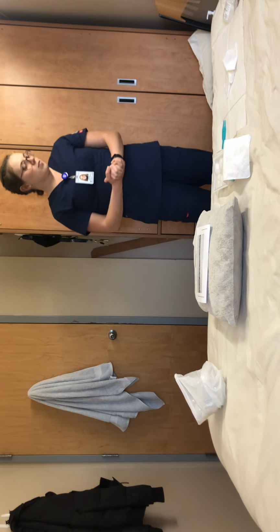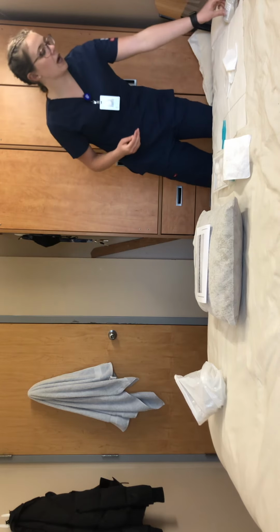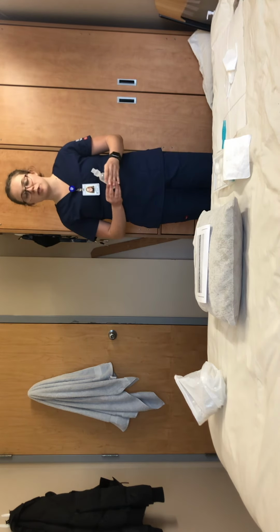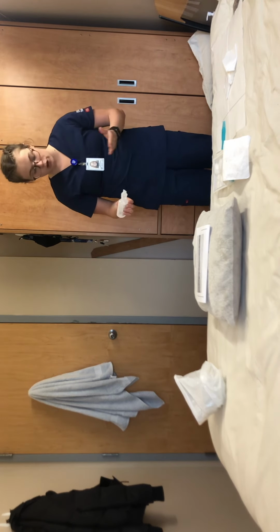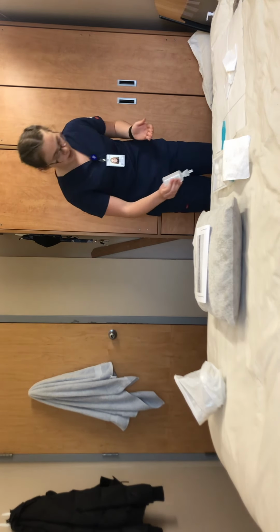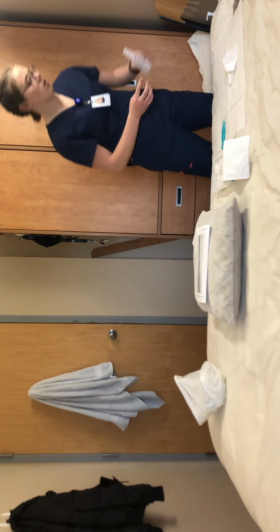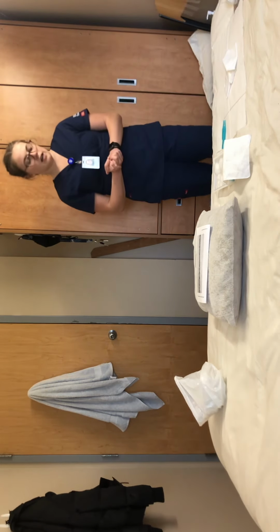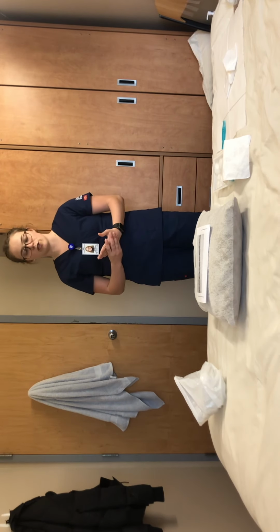Now that I have all of my dry gauze and pads open, I will be getting my solution ready. So we will just be using normal saline today, and I'll be filling up one of the wells of the cotton pads in my dressing tray, to however much I need.